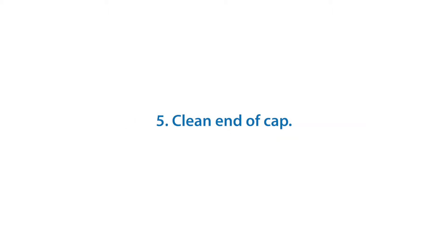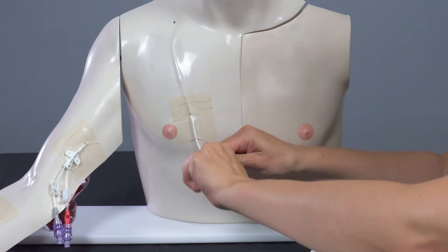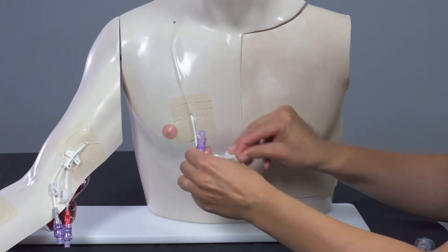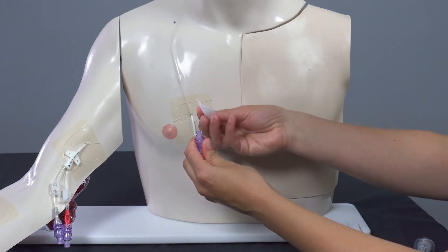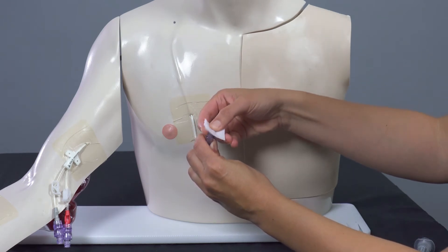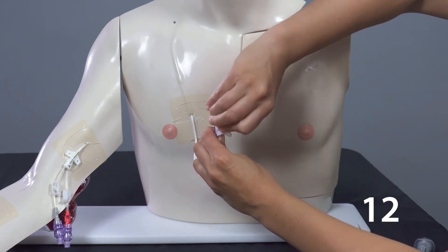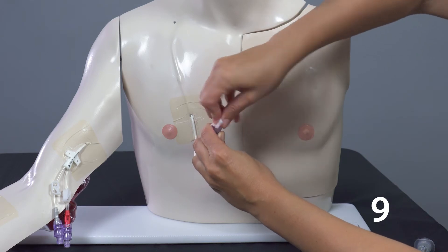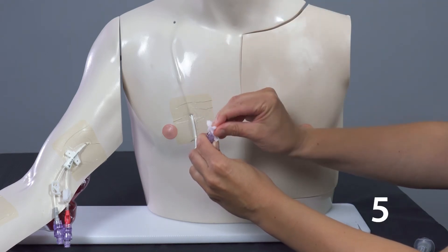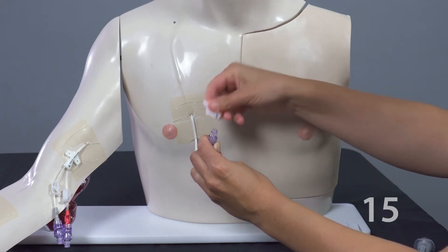Clean end of cap. Remove the orange or green cap cover and discard. Keep the clear cap on at all times. Using your non-dominant hand, pick up the end of the line. With your dominant hand, scrub the end of the cap with an alcohol pad for 15 seconds. Firmly scrub the top of the cap and the threads on the side of the cap. Let it dry for another 15 seconds.